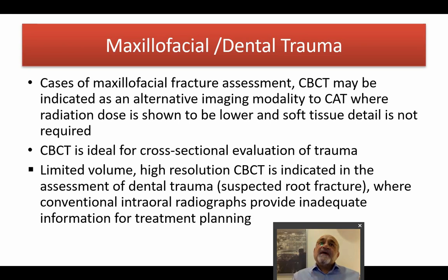Because of the possibility of transmission of fractures to other remote sites from the fractured area, especially in the mandible, where you know that the mandible is a dense bone. So if fracture forces are transmitted to remote areas, they will be overlooked. So go for CBCT with a large field of view.